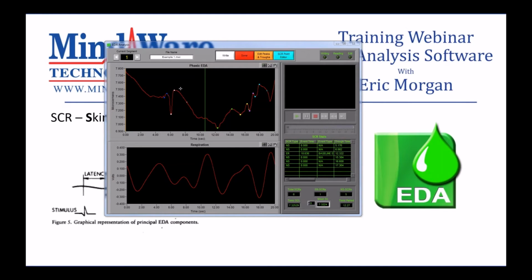So an SCR consists of a trough followed by a peak and occasionally a half recovery time, or the point at which the EDA, or skin conductance, has dropped to less than half of whatever it took for the trough to the peak. And we can see those identified by a square at the trough, a circle at the peak, and an X for the half recovery. And we see that there are several skin conductance responses that have been identified in this segment.